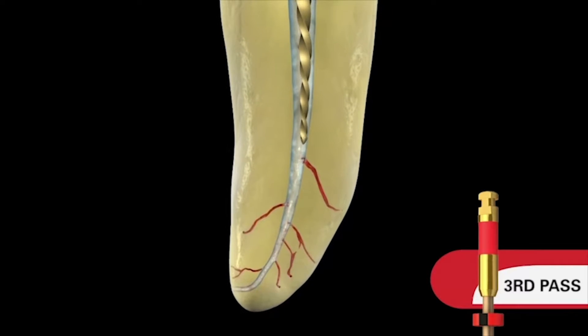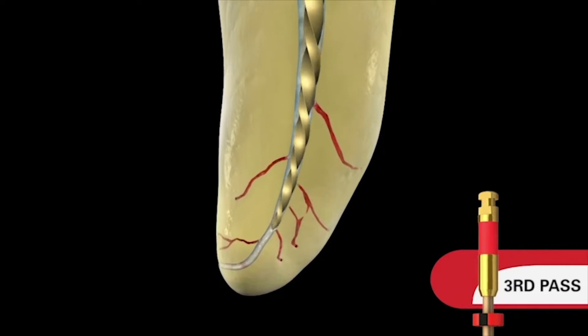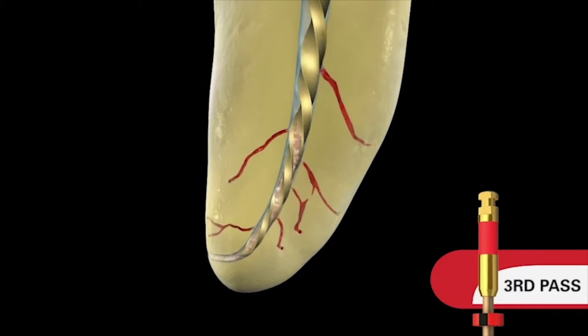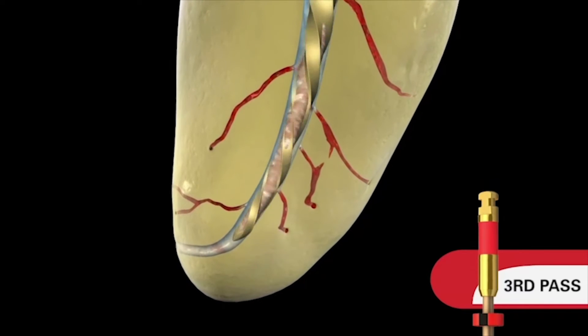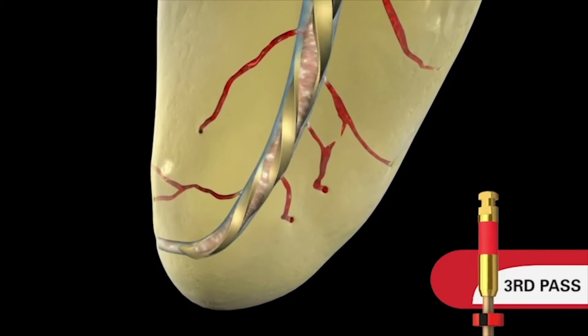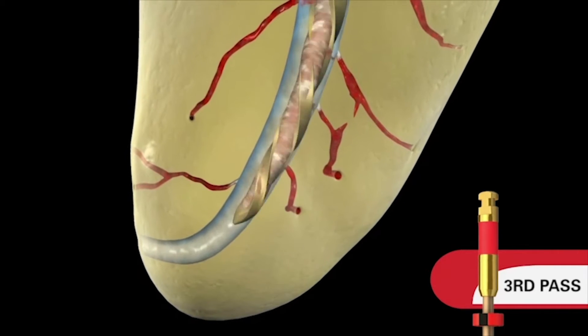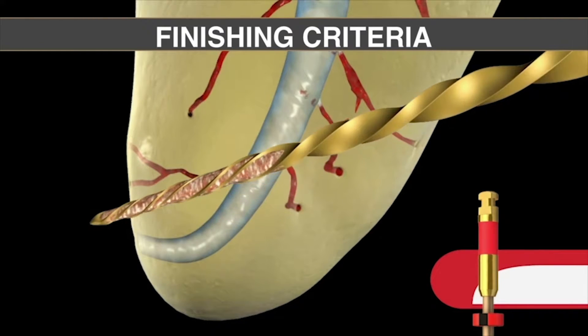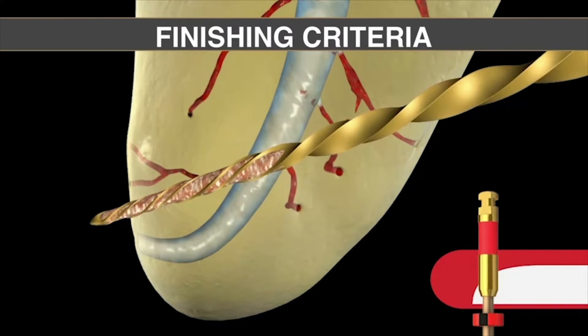Irrigate, recapitulate, and then re-irrigate. These are critical steps that should never be overlooked between the use of any given shaping file. On the third pass, the instrument will travel through the body of the canal passively and begin to work towards its apical extent in the apical one-third of the root. Notice how this instrument is loading up, how flexible it is, and how it can crawl around curvature all the way to length. Remove the instrument, irrigate, recapitulate, re-irrigate.